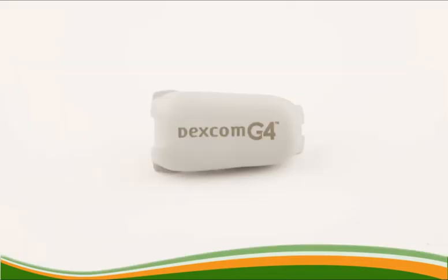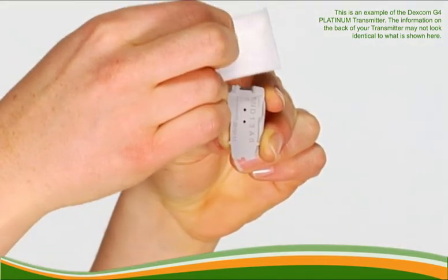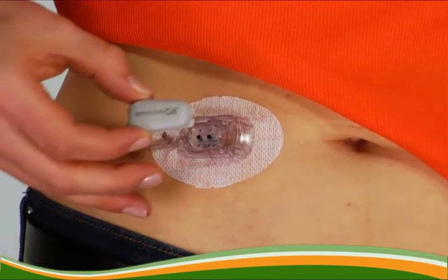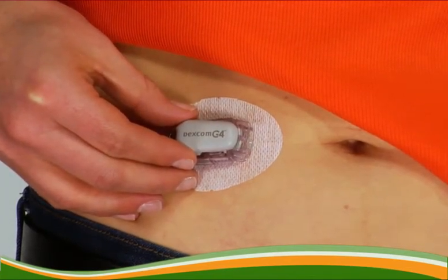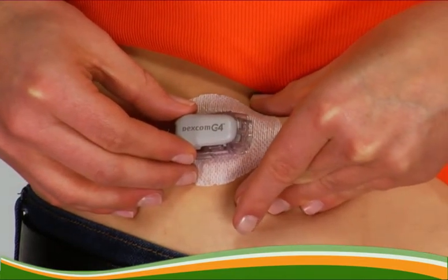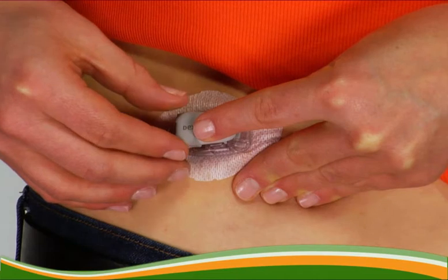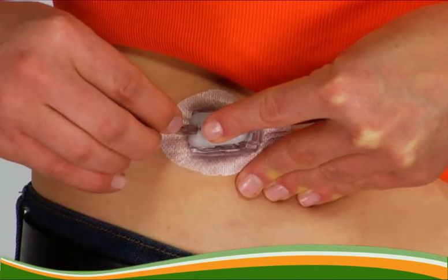Once your sensor has been inserted, it's time to attach the transmitter. First, if you haven't already done so, clean your transmitter with an alcohol wipe and let it dry. Once it's dry, place your transmitter into the sensor pod, flat side down, thinner side away from the transmitter latch. With one hand, you may want to pinch up on your skin at the front tips of the white adhesive. Use a finger to hold the transmitter in place. With your other hand, move the transmitter latch forward until you hear two clicks. This may take some force.